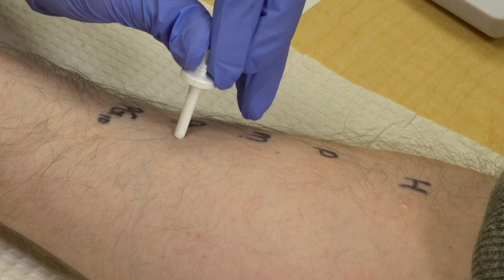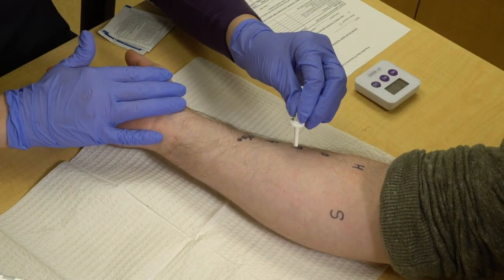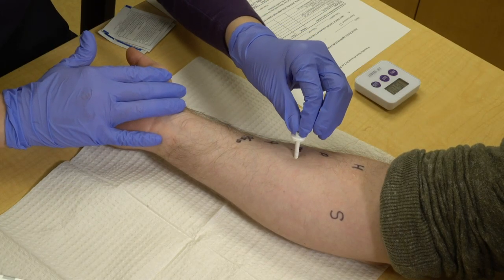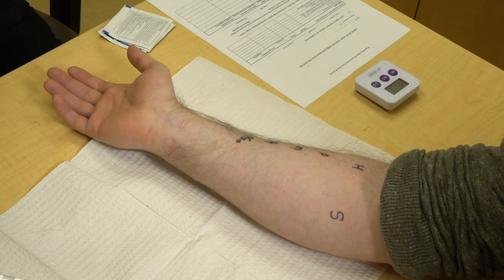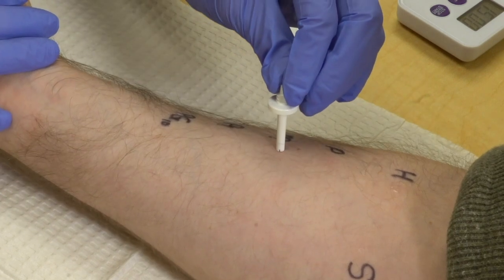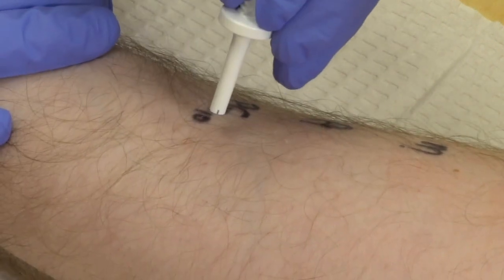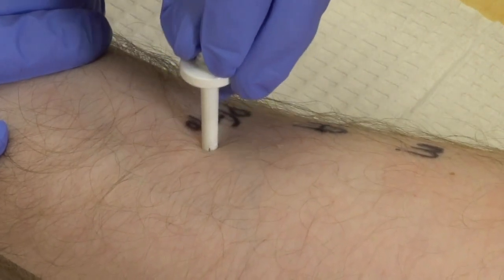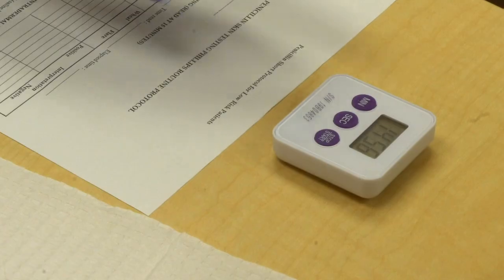The placement of testing reagents doesn't matter, but it is best to place the histamine furthest from the drug reagents, because the flare can bleed into the next test if a patient has a strong reaction to histamine. Using a prick device, place the reagents on the volar surface of the lower arm. Use a positive control such as histamine 1 mg/mL and a negative control such as saline or glycerin. The motion of the skin prick is either a press and slight twist or shallow scooping — the goal is to lightly break the skin.